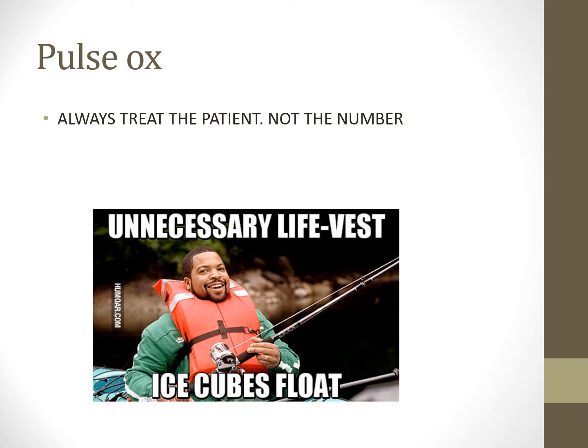So I was trying to feel, is there an issue with the A-line? Is there an issue with their blood pressure together? Is there vasoconstriction? Is there hypothermia of their distal limbs where we were checking their pulse oxes? And so to the family members and to the patient, that seemed reassuring, doing that little hand gesture. But for me, as an assessment as a clinician, I was actually hiding that. I was actually assessing their perfusion to their fingers and toes and how accurate their pulse ox is.